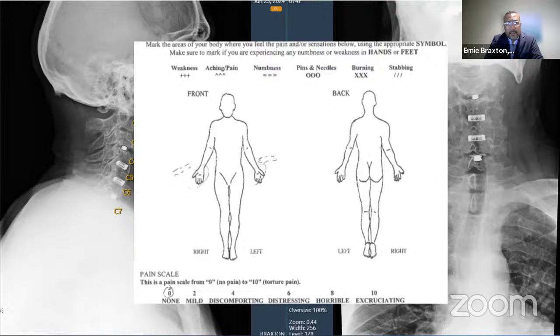He was really pleased with his surgical result in terms of balance, coordination, and certainly pain. I told him I need to see him in 2 months for more x-rays and to continue to follow him. And the nice thing about this disc, it's a ceramic disc. So if I need to get an MRI to evaluate the decompression, it shouldn't be a problem.